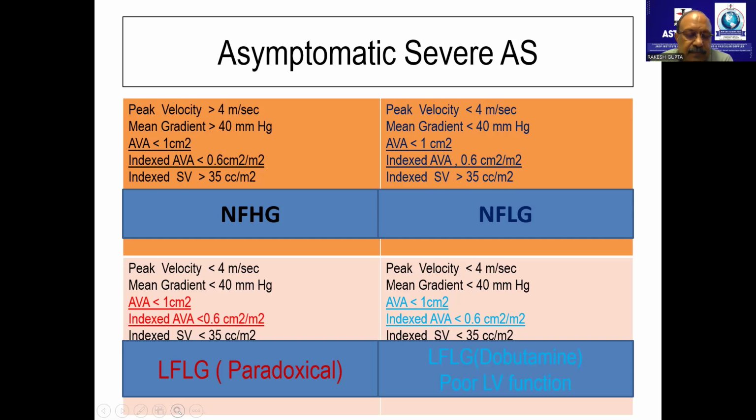But the volumes are increased, so will they cause high gradients? Volumes will not increase the gradients. Pressures will. Volume will always increase the peak gradients, not the mean. Okay. So in the criteria, we have the mean gradient. Look, I never said peak gradient. I said mean gradient, the average of all instantaneous gradients. You just trace the Doppler spectrum pattern, and it will give you peak velocity, peak gradient, mean velocity, and mean gradient.